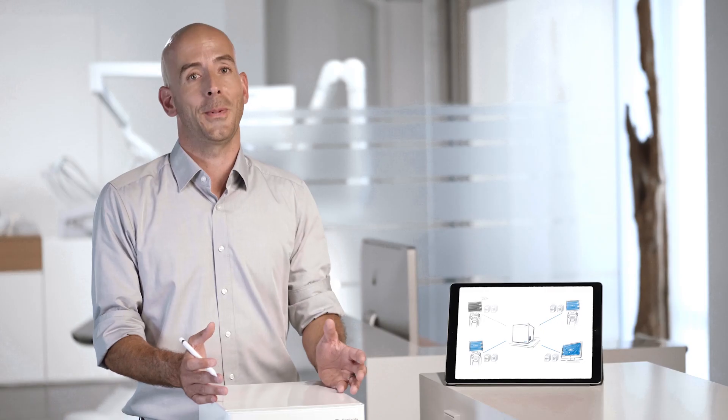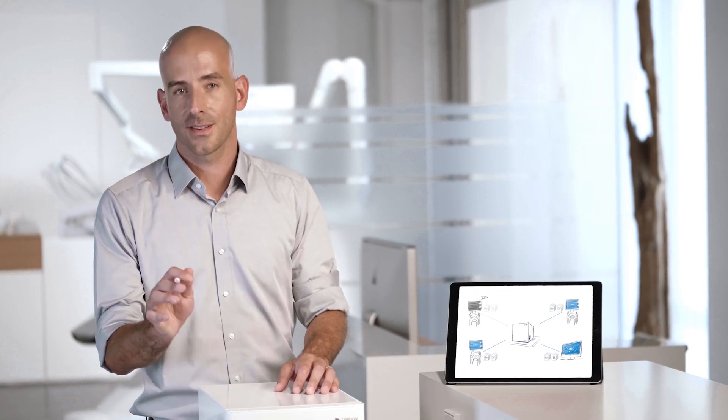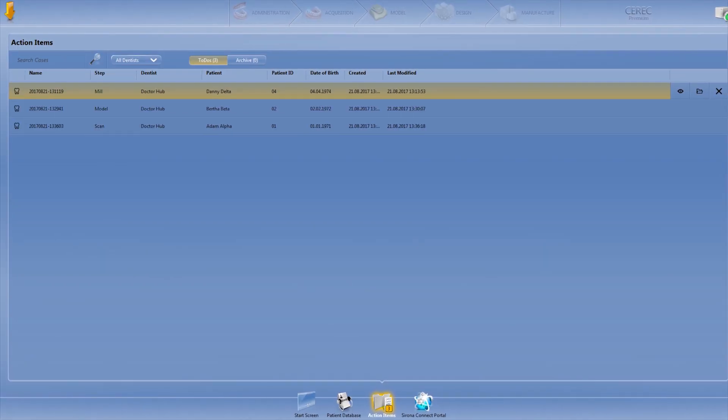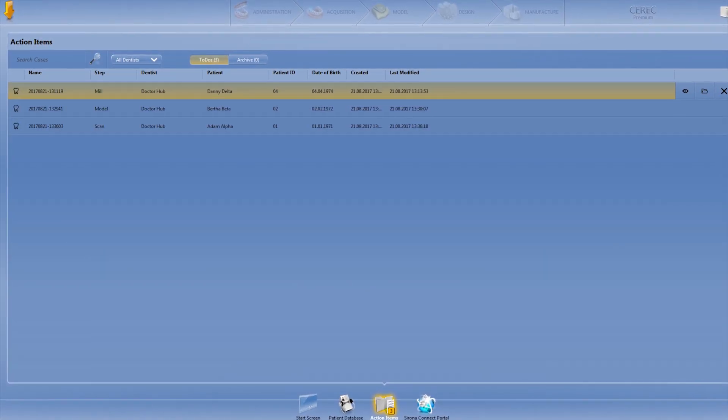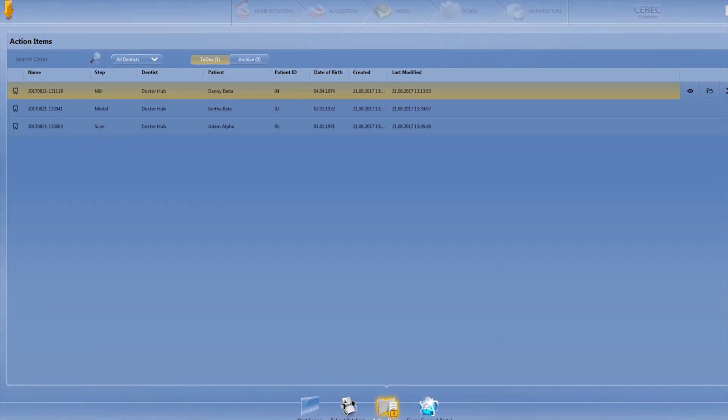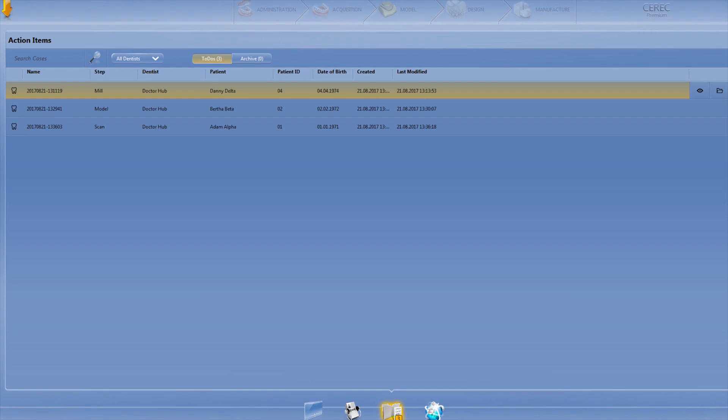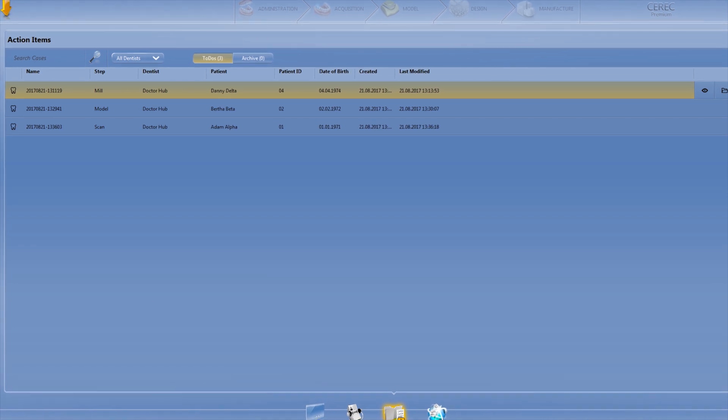Not bad, huh? But here's the best part. In a shared action items list, all current CEREC cases in the Practice are shown, including their status.